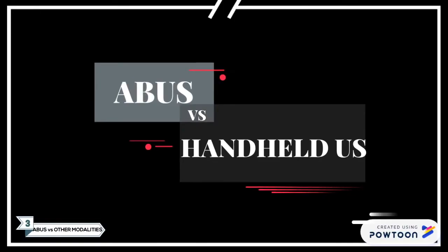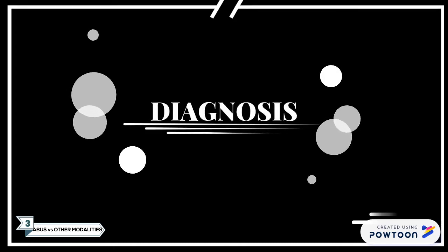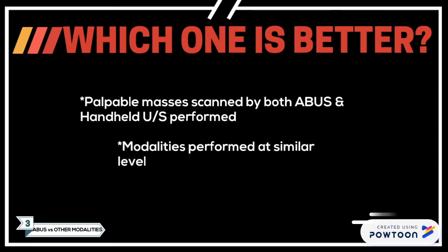ABUS and handheld ultrasound have been compared in hopes of improving patient care. But is there a clear winner for this battle? Let's first investigate if one modality is better in terms of diagnostics. There has not been definite evidence that one modality is better than the other. Patients with a palpable mass were scanned by both modalities. It turns out that both modalities performed at a similar level with insignificant differences.